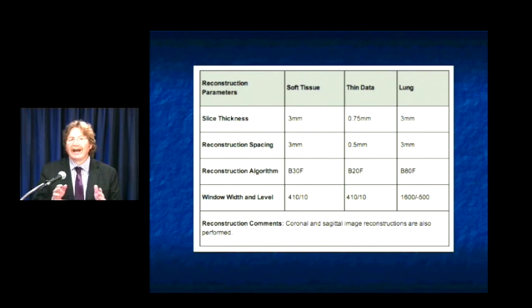You don't want to have 1,000 protocols, but you probably need somewhere in the range of 100, and they need to be very precise on each one of your scanners. And at times, many of you have different scanners, and you need to make certain that the protocols are adapted specifically for each of the individual scanners.